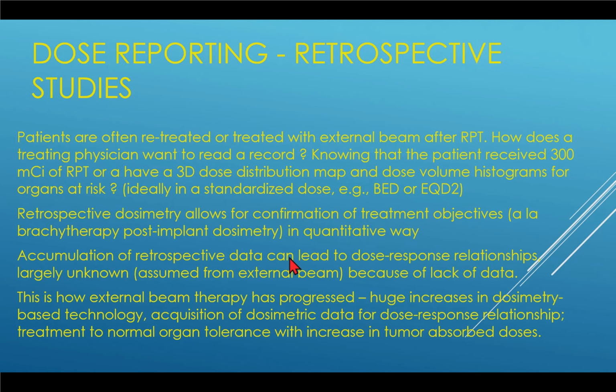And another, if you bring those two together, close together, you can not just combine, but you can prospectively combine, say we can plan a combination, because maybe boosting one with the other is a way to go, and that's also becoming more commonplace. Then it's a similar problem. How do we combine those doses?